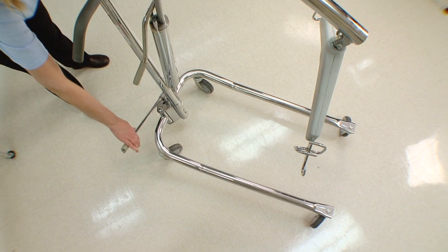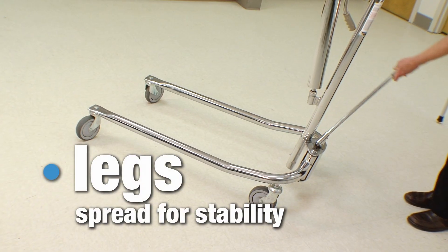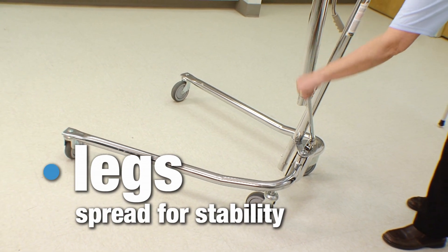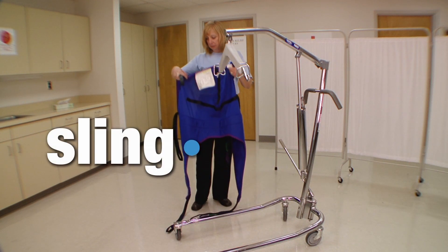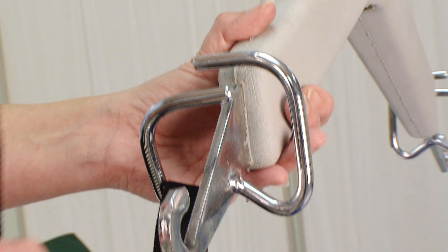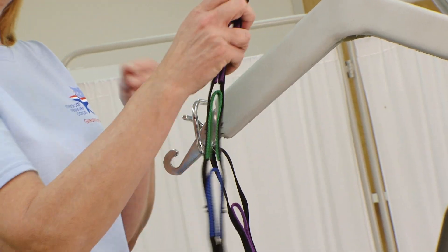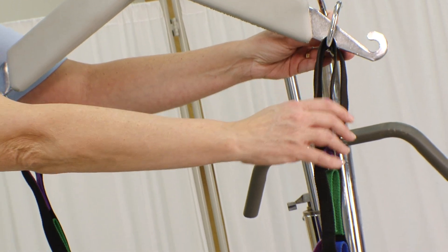The base of the lifter is designed to allow you to spread the legs of the lifter by turning the handle on the base. This is important to provide stability and keep the lifter from tipping. The sling will be placed under the individual and then attached to the cradle — note that there are three color-coded loops on the flaps. Be sure to note the colors when you are using it on the individual.